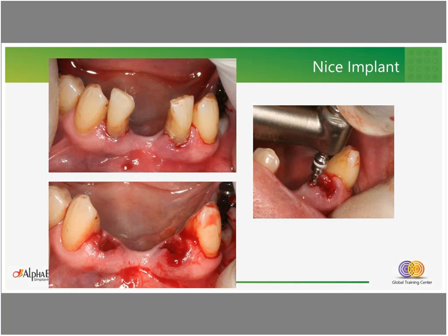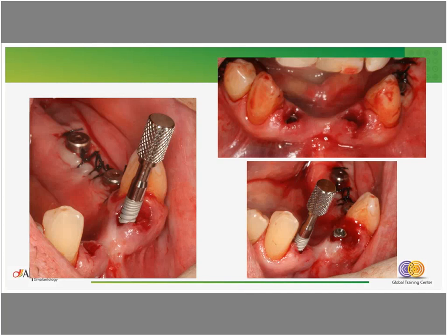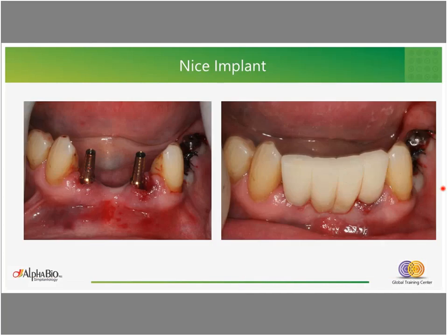It's a very narrow body implant with a conical connection that can also be an advantage in the abutment shape and restoration. The implants were inserted according to the drilling protocol, and finally abutments were connected with a suitable cuff height in order to make the maintenance of the case easier, and the temporary immediate restoration was cemented on the abutments, of course, out of any lateral or occlusal contacts.